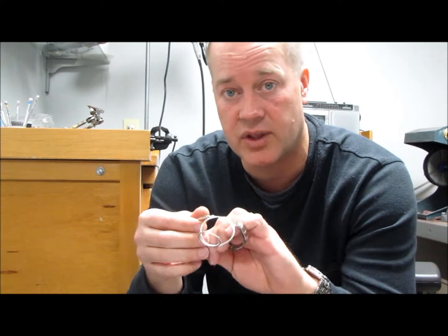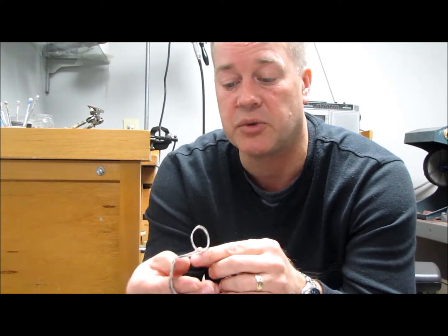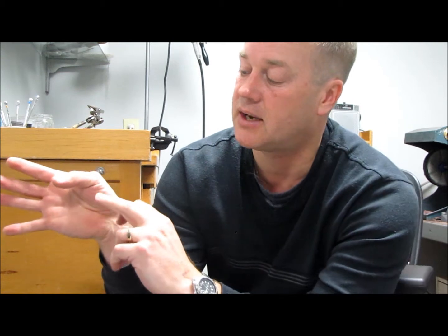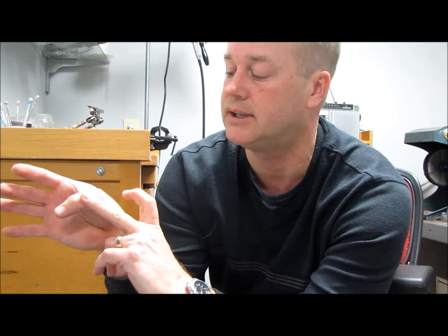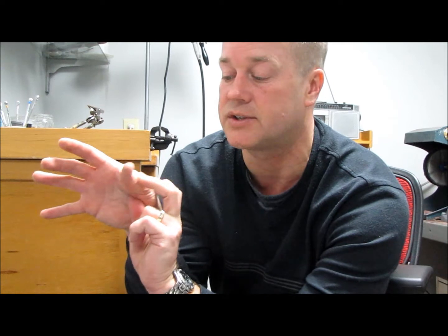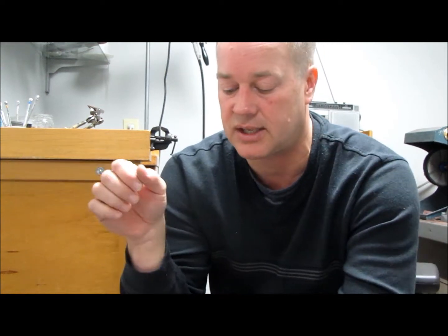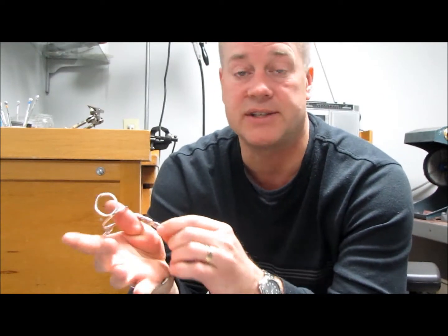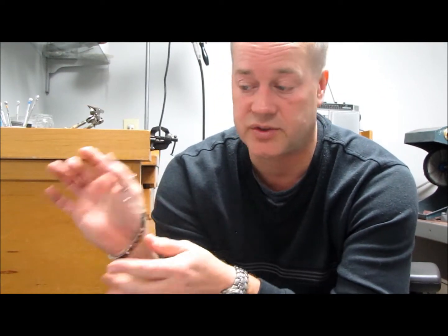And we do have a splint for that as well, and this is called the thumb MCP splint. Basically, it comes with a bracelet, and that's so we can anchor it in place. But with the thumb MCP, again, if we can apply some pressure just proximal of the IP joint, and before you come to the CMC joint back here, and right underneath the joint, again, we can stop hyperextension. But we don't really have anything to anchor it in place, and that's why we use this type of an expansion bracelet. So basically, slipping your hand through, the bracelet holds the splint in place, and again, that's as far as I can go if I'm hitchhiking or if I want to do something functional.